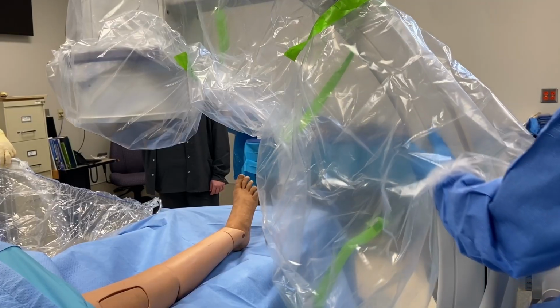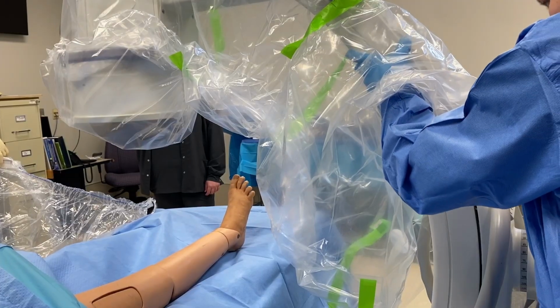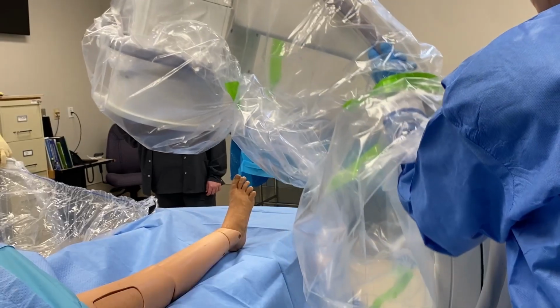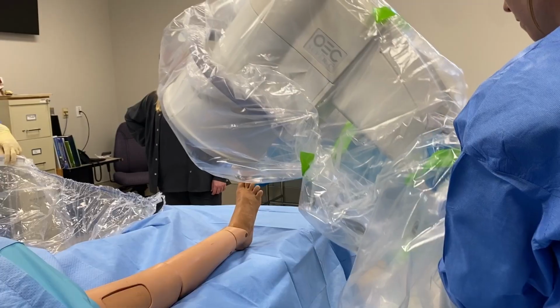Here is an AP projection. The surgeon will tell us when they want a lateral, and that will cue us to start moving the arm in a lateral position, and the surgical techs will then hold a drape that is called C-armor over the tube side of the C-arm to help maintain their sterile field.